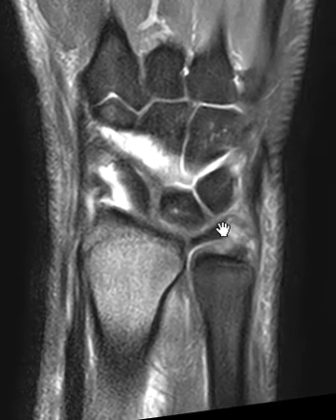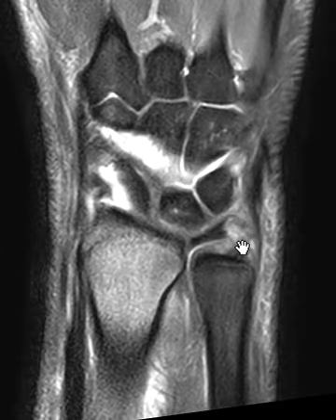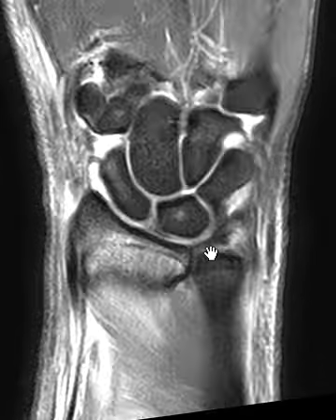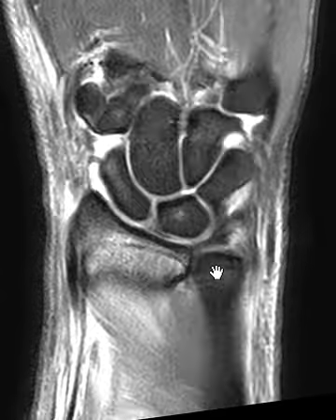It's drifted distally, and now you can kind of see this oblique brightness here — this abnormal signal — this is the torn TFCC distally. In this patient they also have an abnormality down here — this looks like the palmar radial ulnar ligament. These can kind of blend together, the palmar band of the TFCC and these radial ulnar ligaments — it's really hard to separate. But it looks like down here this fogginess is a partial tear of that palmar radial ulnar ligament.